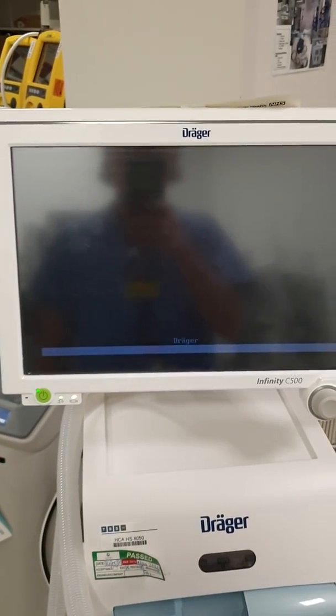So to switch it on, press the button and then we have to wait for about a minute to start up.